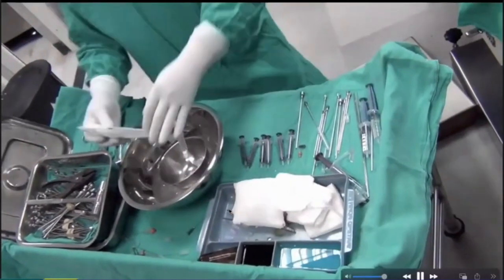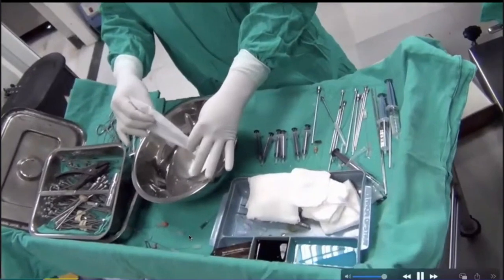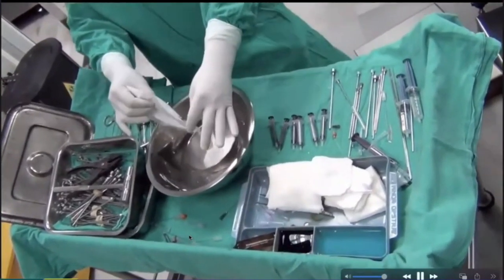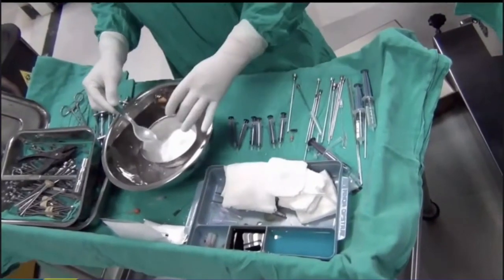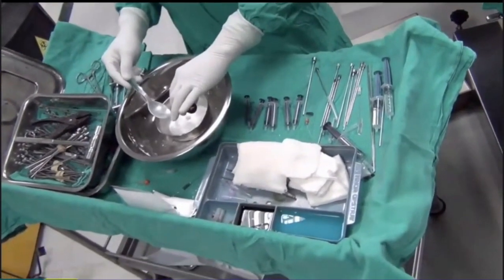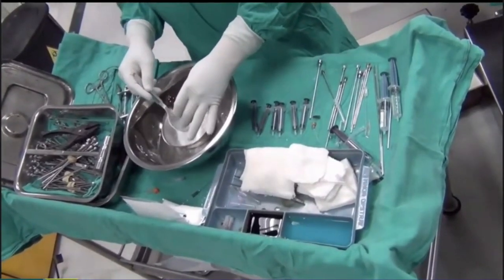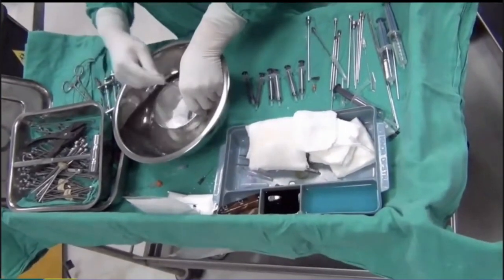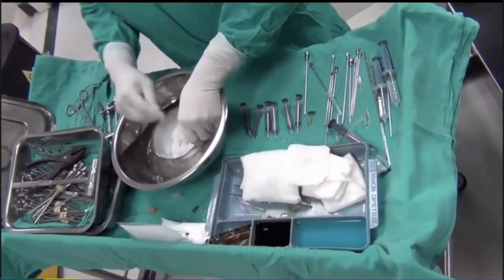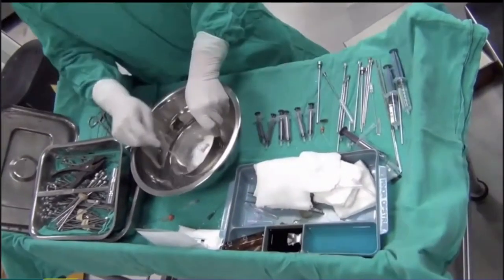You can make your cement to your choice: how soft you want, how viscid you want, or how solidified you want from the cement. So your cement viscosity is your choice depending on fracture morphology, level and safety, and whether it is a posterior dehiscence, or you're worried about leak. If there's a leak worry, then make it a more solid cement. If the leak is not a worry, then you can put more liquid cement also. But in kyphoplasty, you can straight away put a more solidified cement. You don't have to put much liquid cement in. And this is how cement has been made.